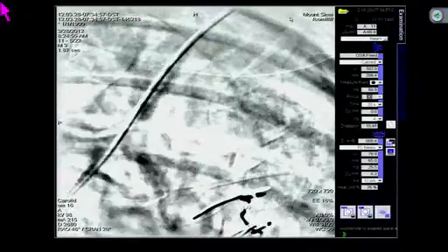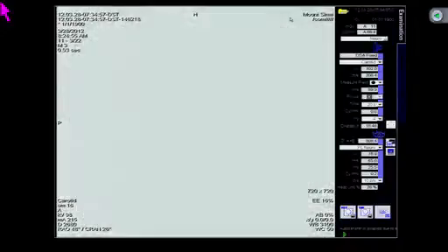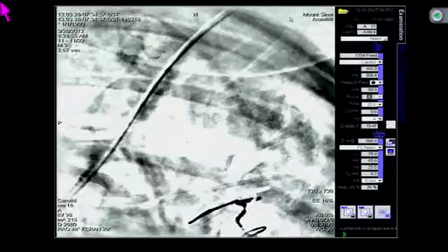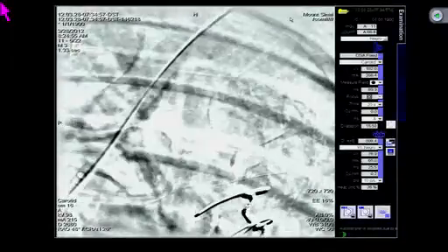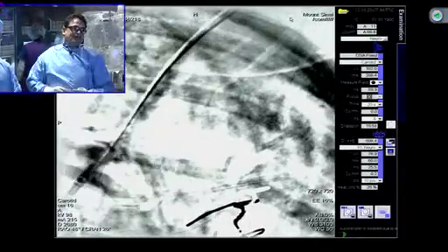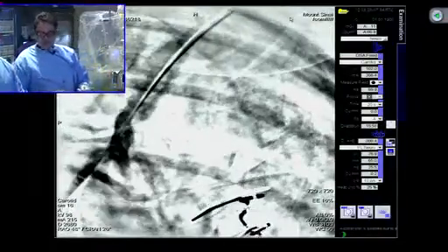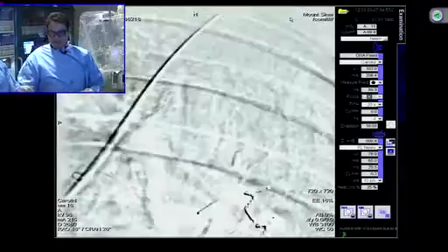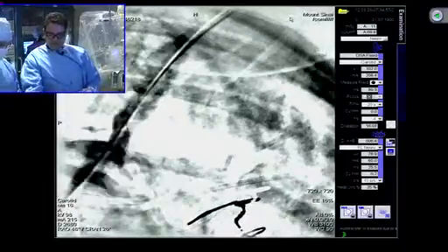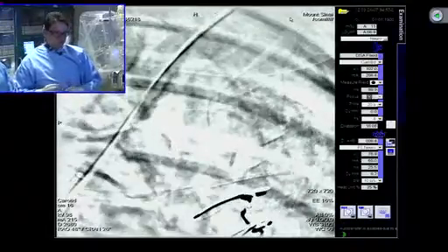It's a heavily calcified lesion, and I still haven't fully expanded it. I did a 4 millimeter balloon in order to be able to get my equipment across. Now I'm going to go ahead with a larger balloon, a 6 or a 7. First I'll do a 6 and then a 7, and really get an idea of how this is expanding. If this expands really well, and all of us in this room are convinced that we've cracked the lesion, then I could go ahead with a self-expanding stent.